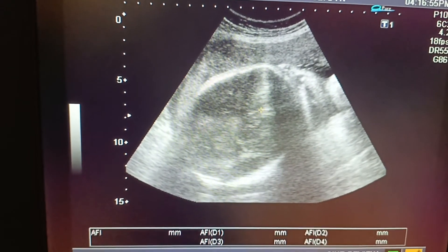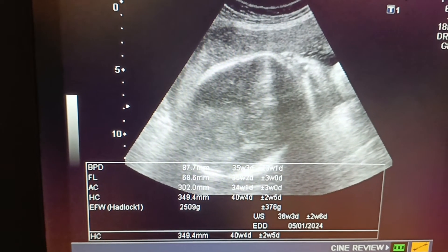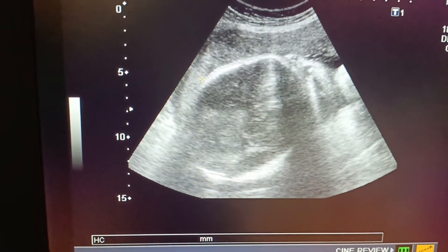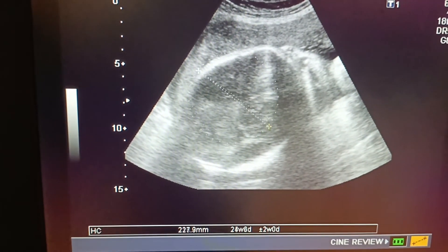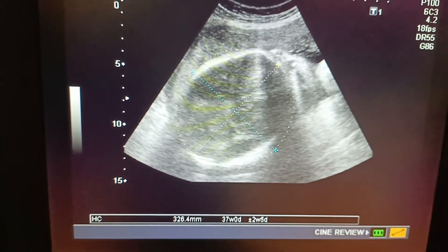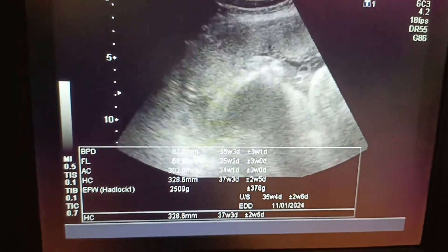The placenta is anterior fundal, slightly low-lying, and it is grade two to three in maturity. The BPD and HC again correspond to 35 to 36 weeks.